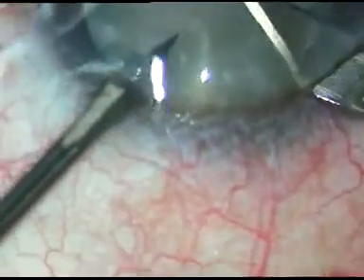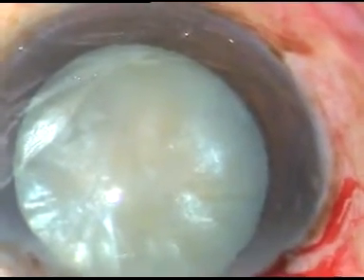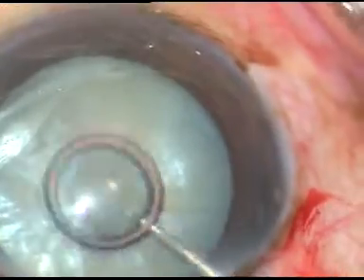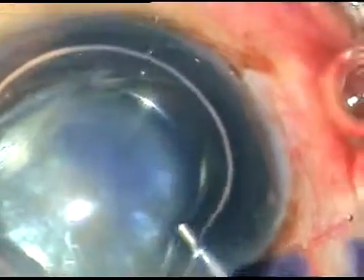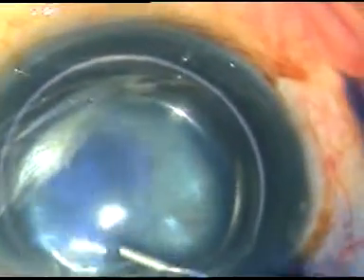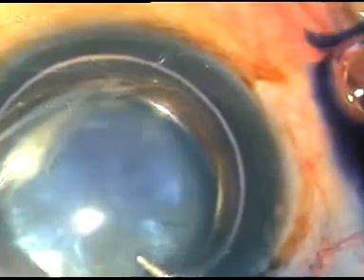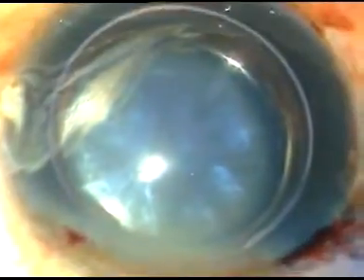Now in this case, I am going to stain the anterior capsule with trypan blue dye. This is an air bubble, and underneath this air bubble, the trypan blue dye is injected. If we use air, the dye doesn't get diluted and staining becomes very fast.